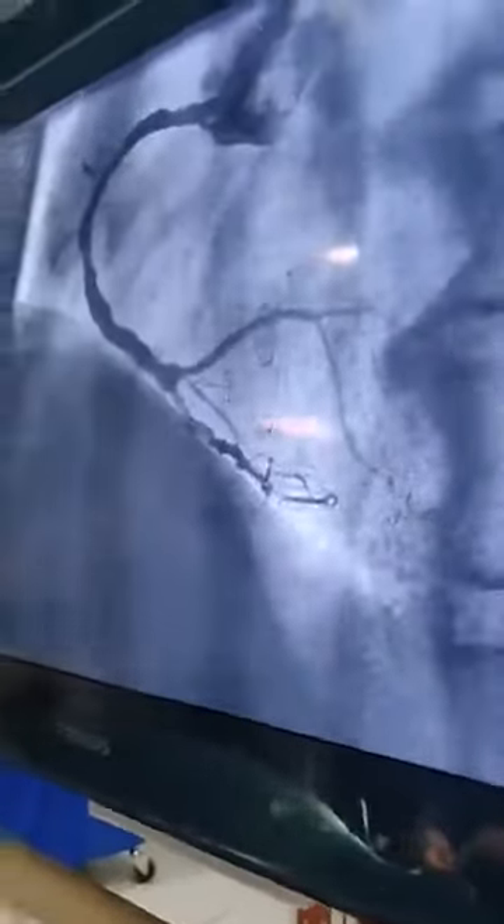Now we are ready with the injection to the right coronary artery. We can see the right coronary artery is having minor blockages. So this finishes the right coronary artery assessment.